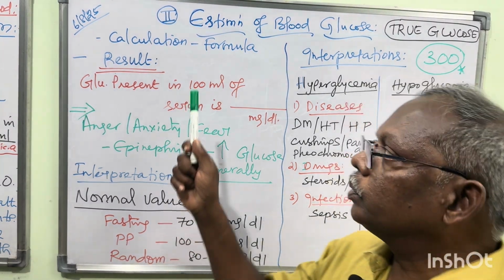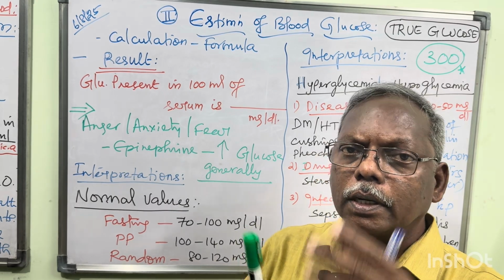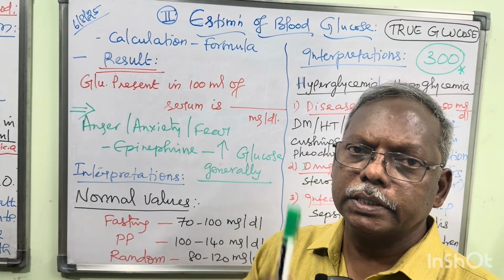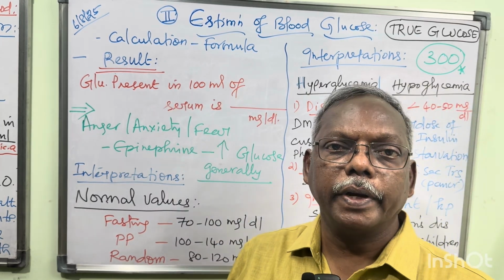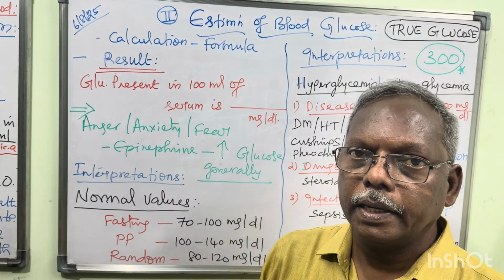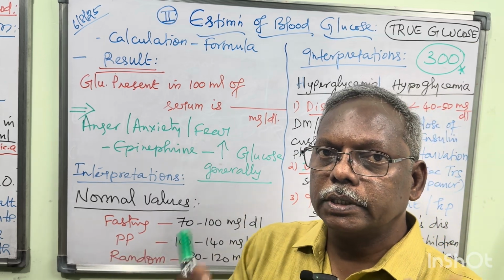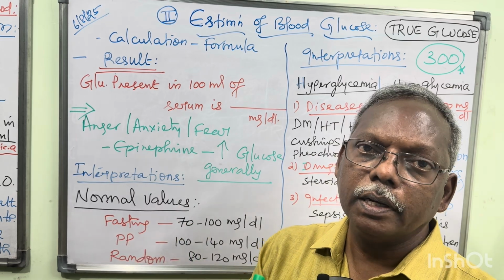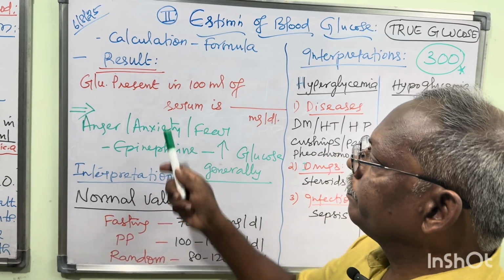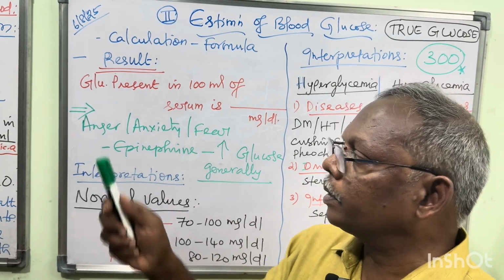Yes, now you are going to write the formula for the calculation. Concentration of the standard, concentration of the blank and working standard, like that. Finally, you find out one result. Right? After the calculation, application of all the OD value, that is blank value, standard value, test value, applying this formula, you will get one result. So the result, how it will present in your paper.